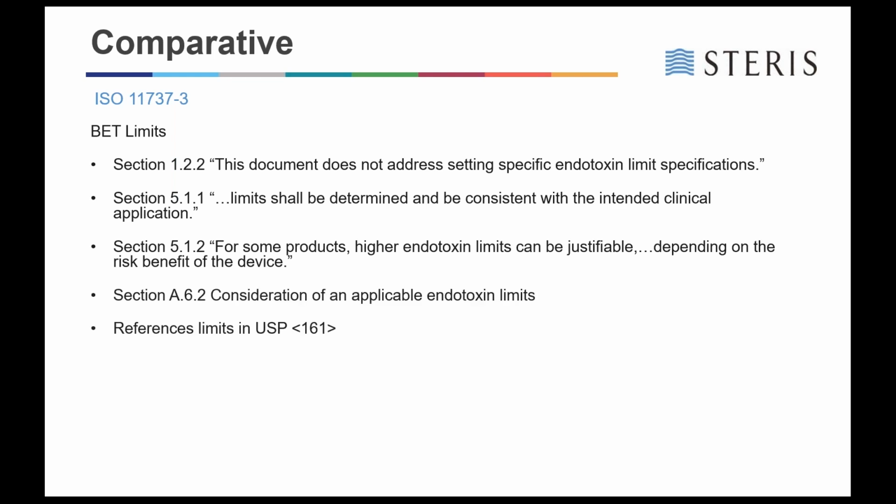And in section A.6.2, the appendix goes into more detail on consideration of the applicable endotoxin limits. And it refers you back to the USP 161 to take a closer look at limits that are applicable within the US.